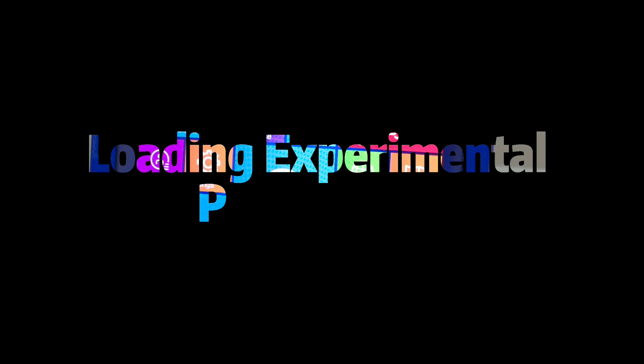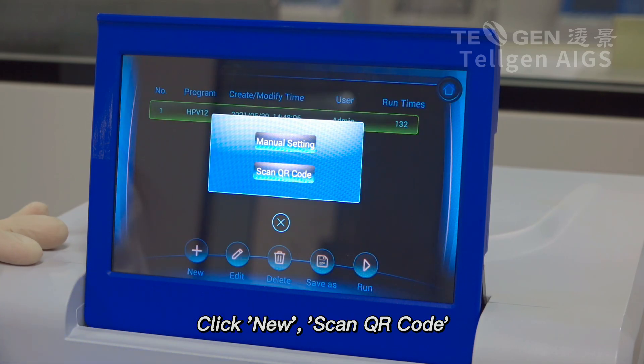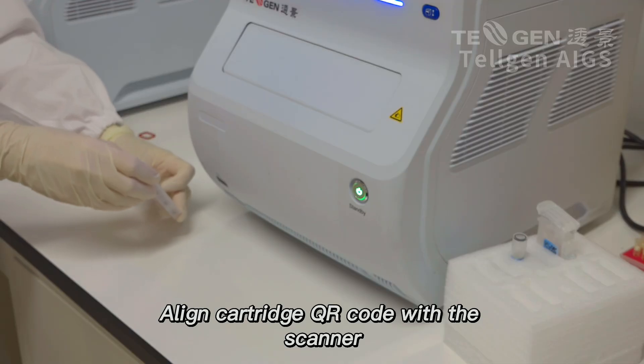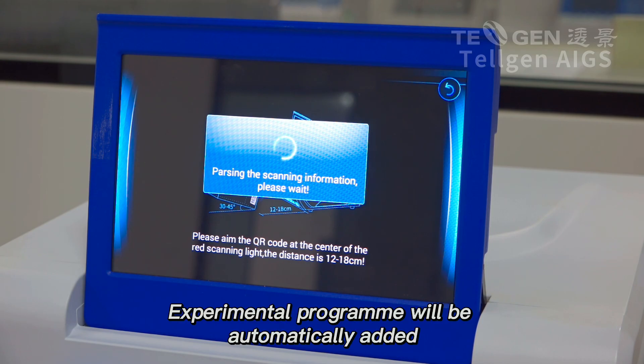Loading Experimental Program. Click on Library. Click New Scan QR Code. Align cartridge QR code with the scanner. Experimental program will be automatically added.